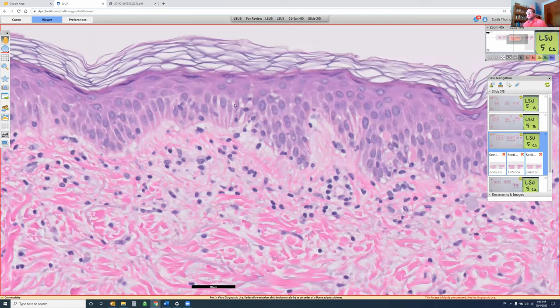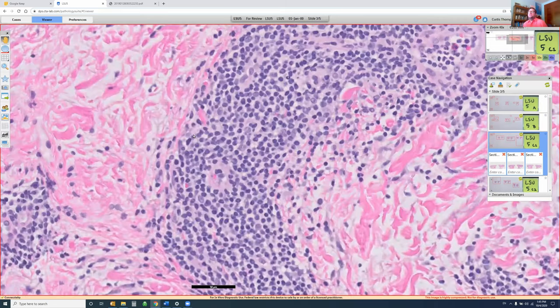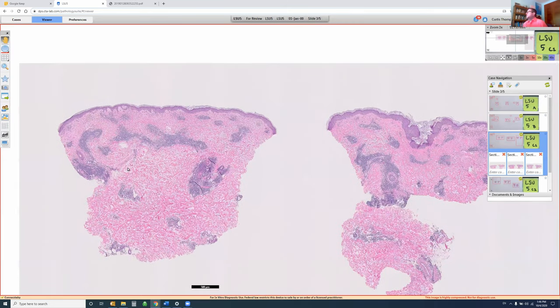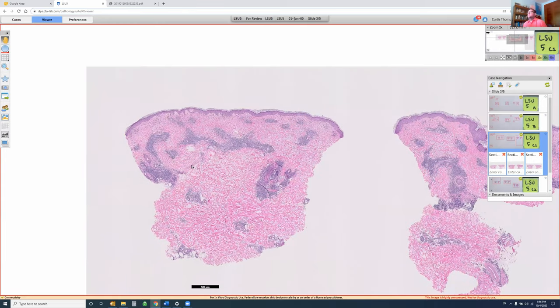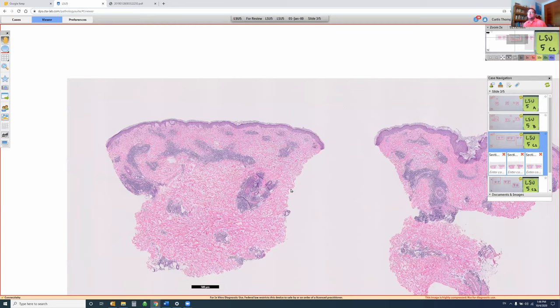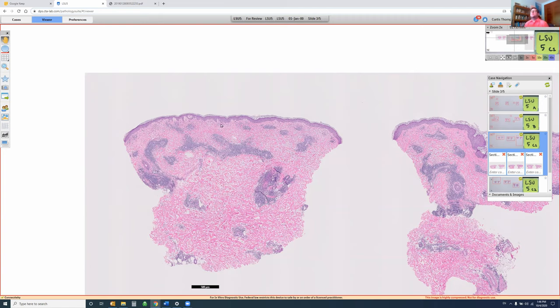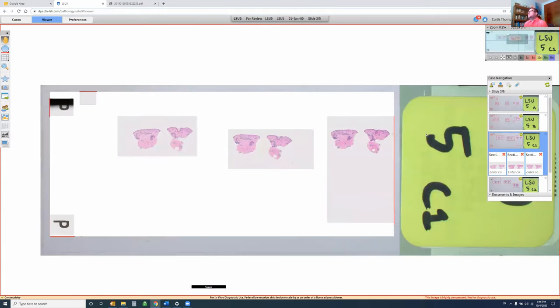Erythema annulare centrifugum biopsied at the advancing edge can be spongiotic, generally not interface. Polymorphous light eruption has papillary dermal edema, which you could almost imagine some of here. One thing: this is a lesion on the upper arm, and if the patient doesn't have lesions on their face, it's unlikely to be polymorphous light eruption. You can go back and do CD123 on this to look for clusters. Keep in mind that a portion of what's been called polymorphous light eruption over the years may actually be lupus — sun sensitive, superficial and deep lymphocytes.